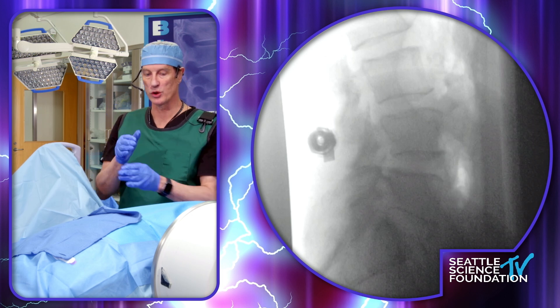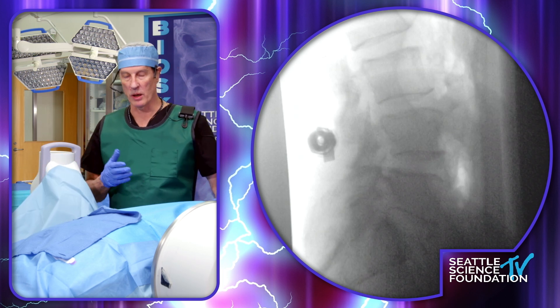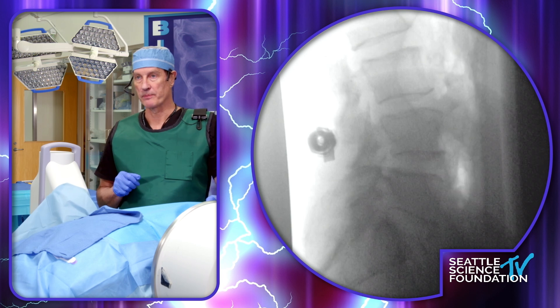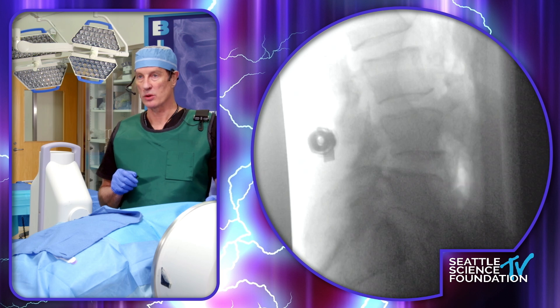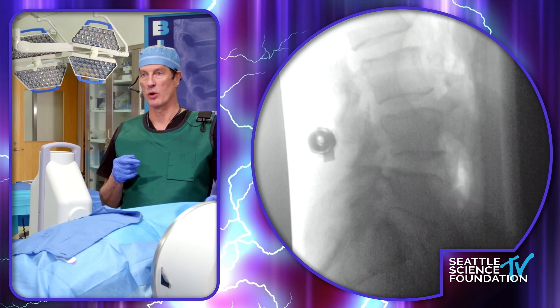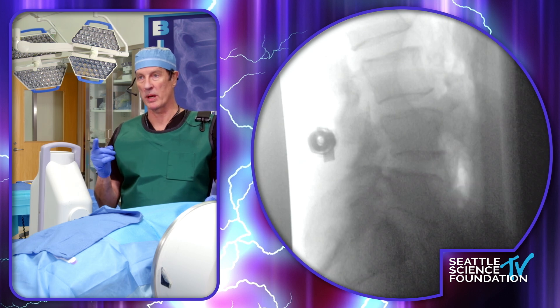This facilitates fusion. There's a paper we wrote a couple of years ago, published last year — Matt Skoblar is the primary author — reporting a 93% fusion rate with these. These are also hydroxyapatite coated, which speeds up the process of bone incorporation via cation exchange. These fuse very effectively. The only one in that paper that did not fuse had a halo around it — so something was wrong, maybe a P. acnes infection or something like it.